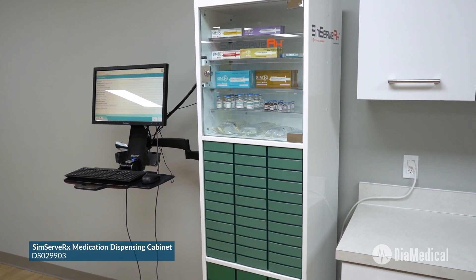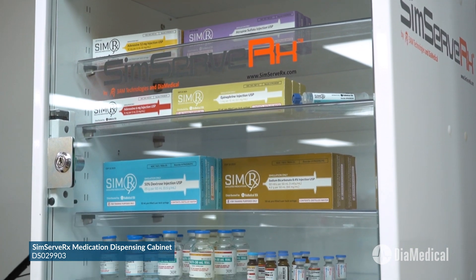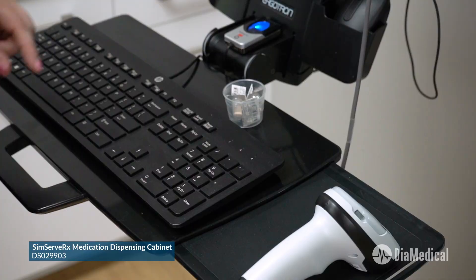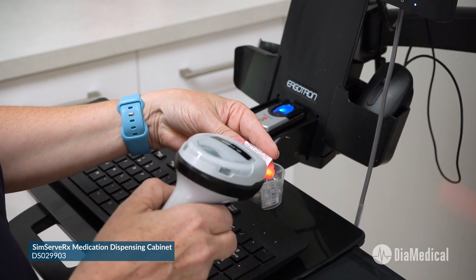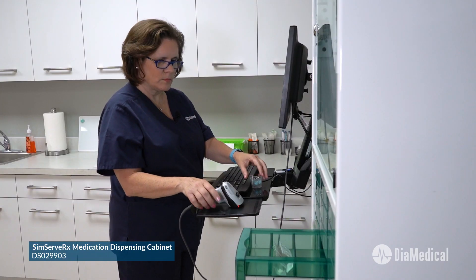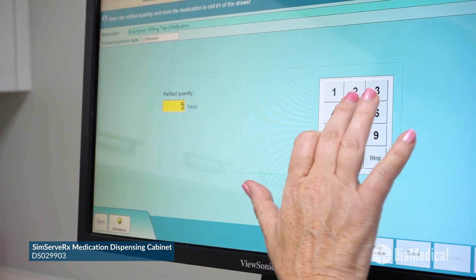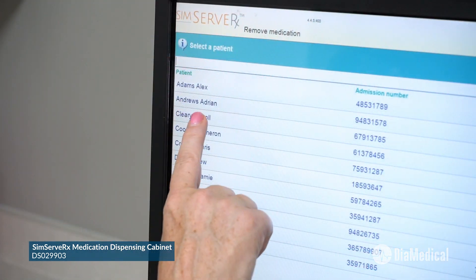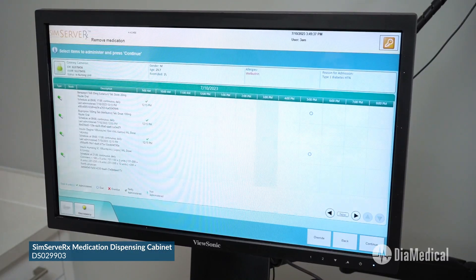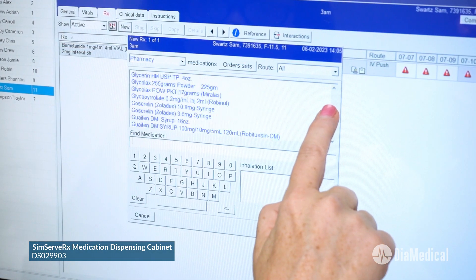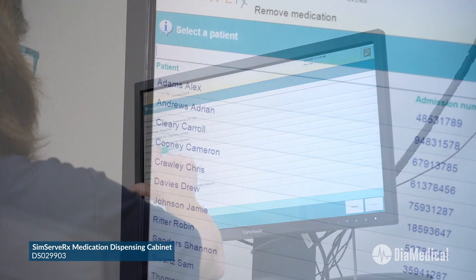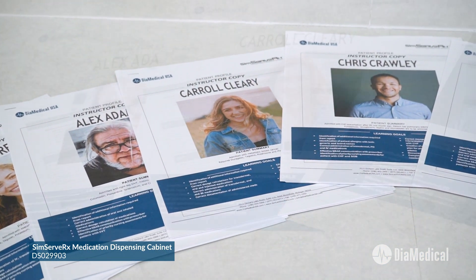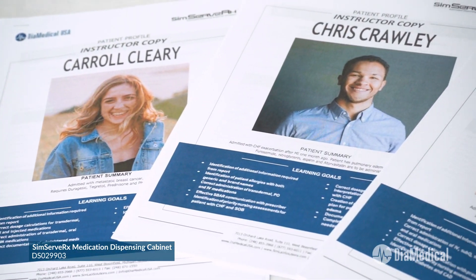SimServeRx is an automated med management system that was designed specifically for healthcare education. It allows instructors to simulate both dispensing and administration right in the classroom or at the patient's bedside in the SimLab. SimServeRx dispensing cabinets feature a comprehensive software package with a simulated EMR, med orders, drug library, and inventory management. They also include a set of 10 pre-programmed patient profiles that provide plug-and-play convenience for instructors.